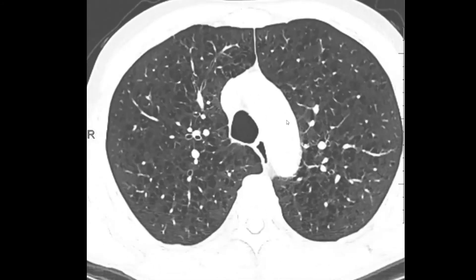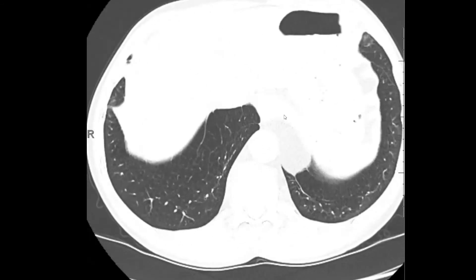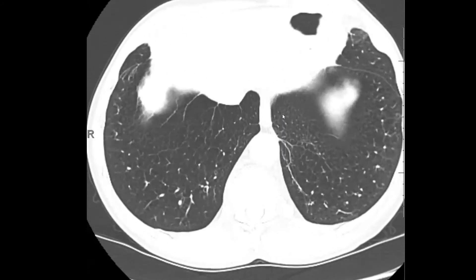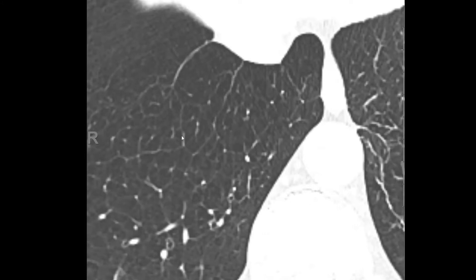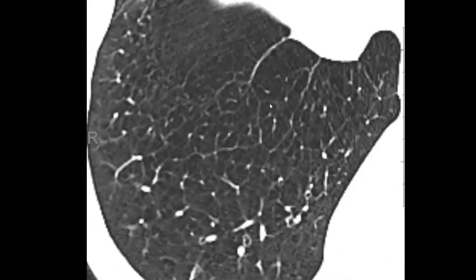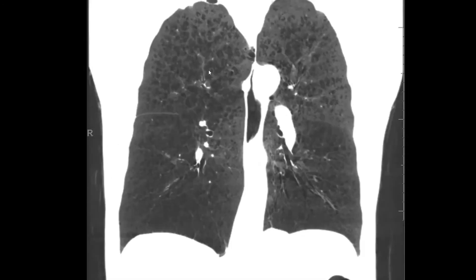As we scroll down to the lung bases, there is another type of emphysema here which is difficult to see because there's really no frame of reference once you get down to the lung bases. But there's actually panlobular emphysema here. Panlobular emphysema is going to be at the lung bases and involves the entirety of the secondary pulmonary lobule. We see these polygons — secondary pulmonary lobules — that are dilated and hypodense relative to normal lung.